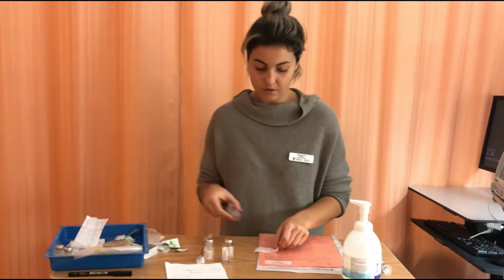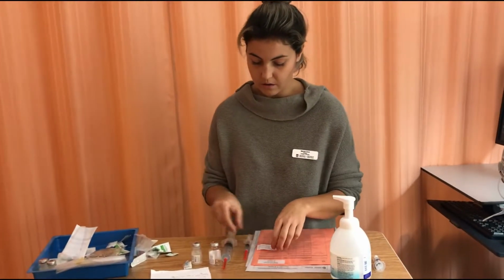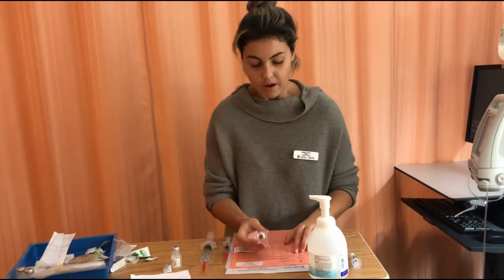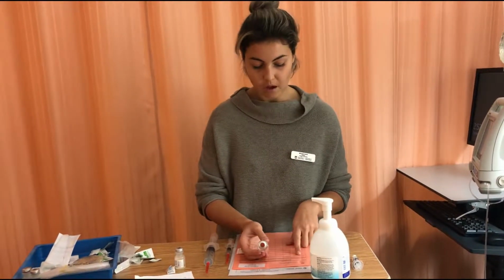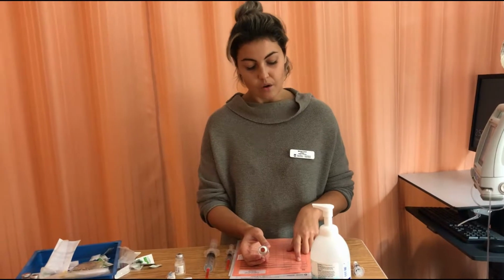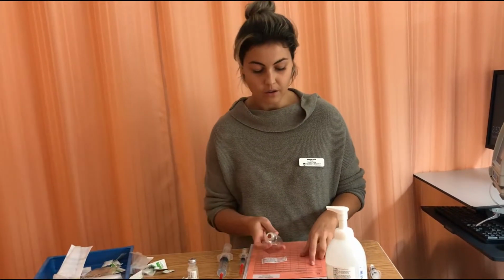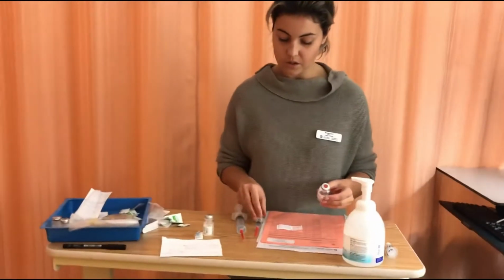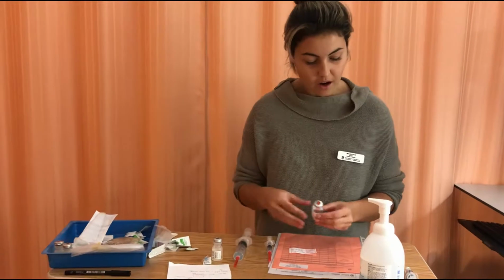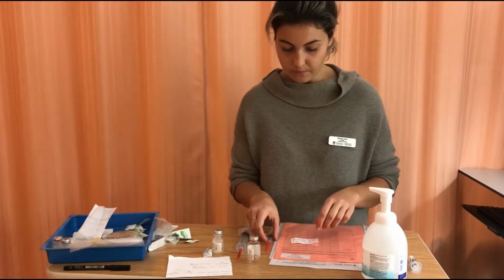I'll do my third check. So the right patient, my patient is on the right side. Vial here, penicillin G, so right drug for Emma, right patient, right dose, 3 million units, which equals 3 milliliters, which is what I have here in my syringe, for IV, and the time is right now.